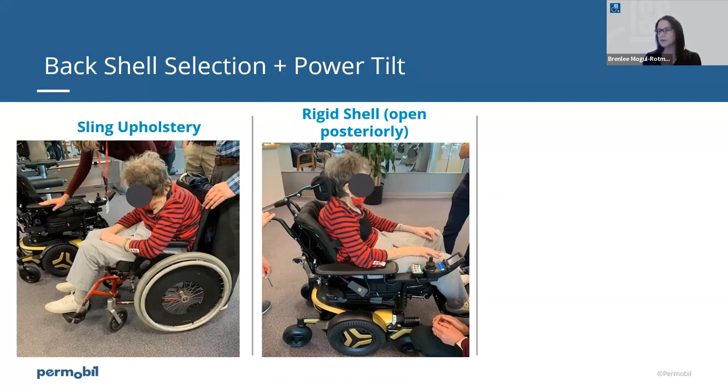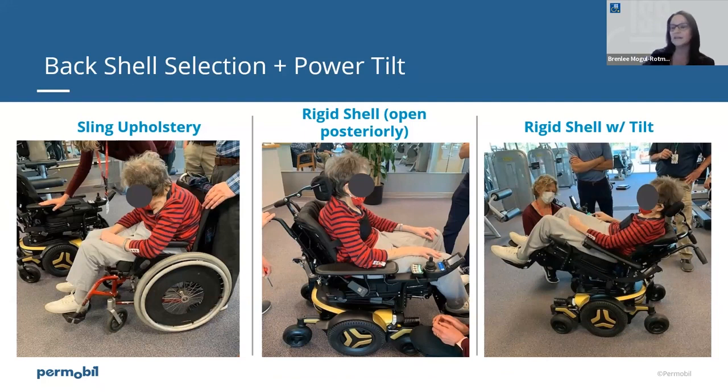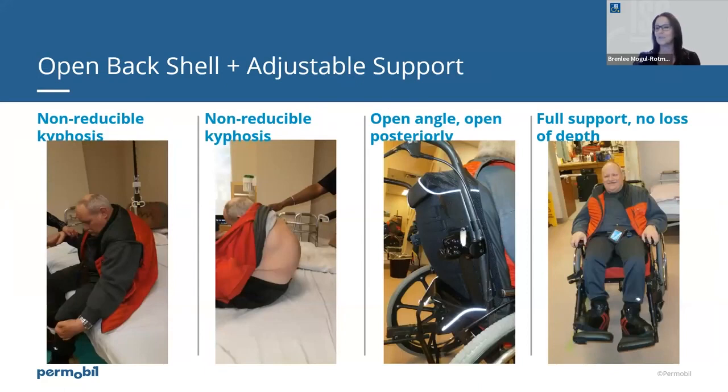And then the use of a horizontal chest strap as her secondary support also assists in a more upright posture for her. And then lastly, the addition of power tilt on her power chair really allows for more shoulder and chest muscle alignment and stretching and gravity assisted positioning. And what her husband found was when she was in this position, he could actually assist her with her lower leg stretches and exercises because she was positioned so much better. So you need to look at our caregivers' needs as well.